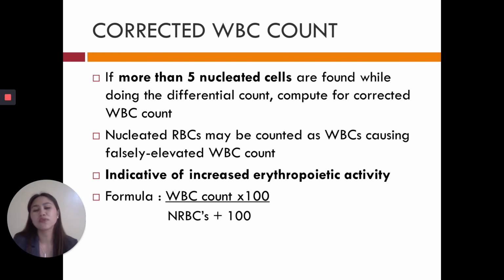Then your WBC count or even your differential count is not the correct count. You have to consider this. If you happen to see more than 5 nucleated red blood cells, you have to recompute your differential count for the corrected WBC.